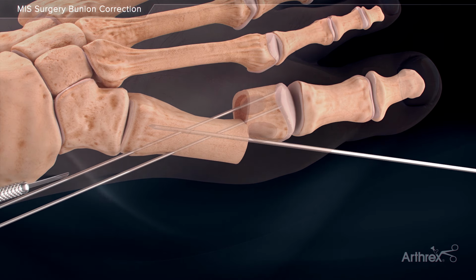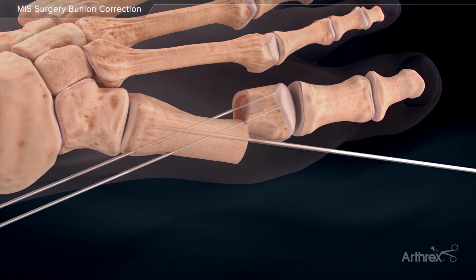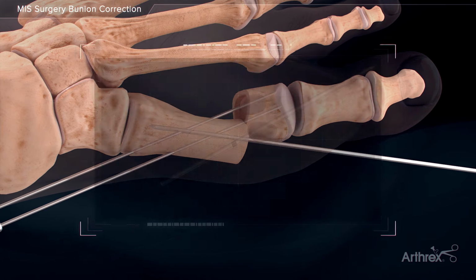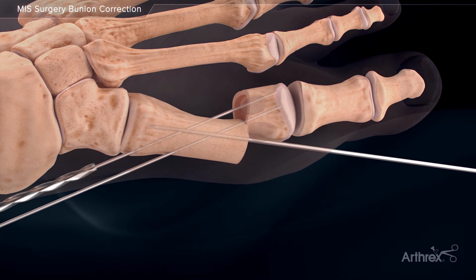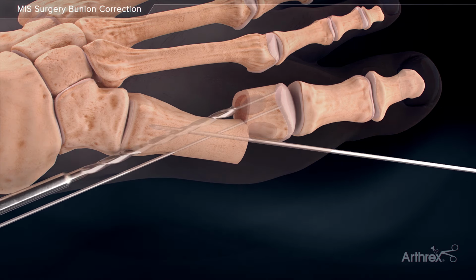Skin incisions are made, and the cannulated depth gauge is inserted over both guide wires to determine the necessary screw lengths. A general rule of thumb is to remove 4 mm from the measured length of the screw. Next, the cannulated drill is inserted over the proximal guide wire, ensuring that the drill is advanced along the entire length of the wire and into the capital fragment.